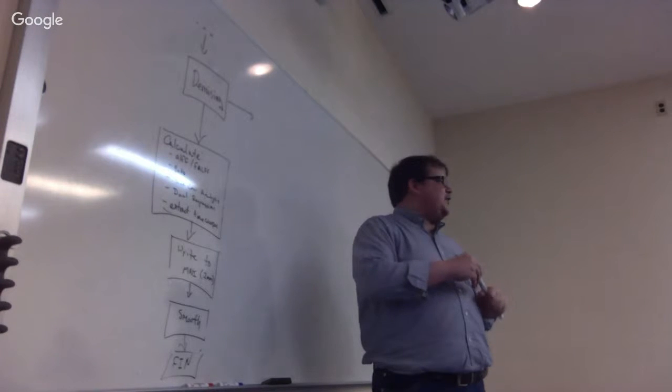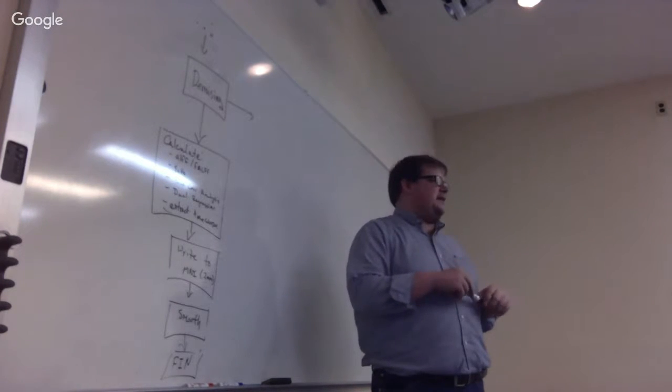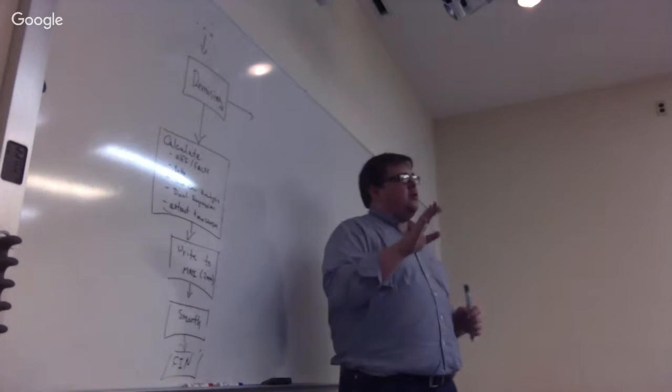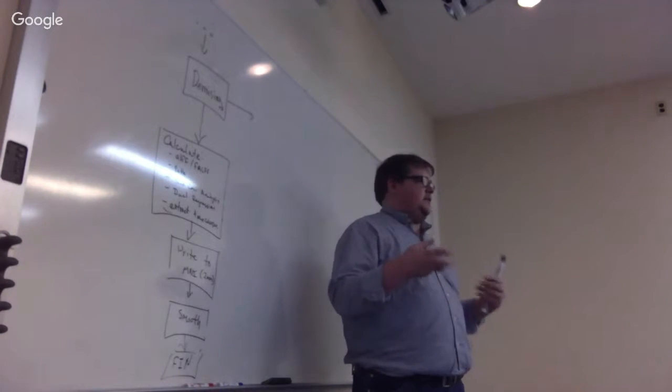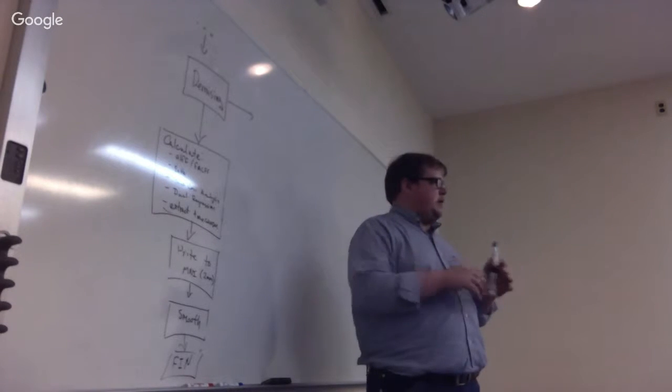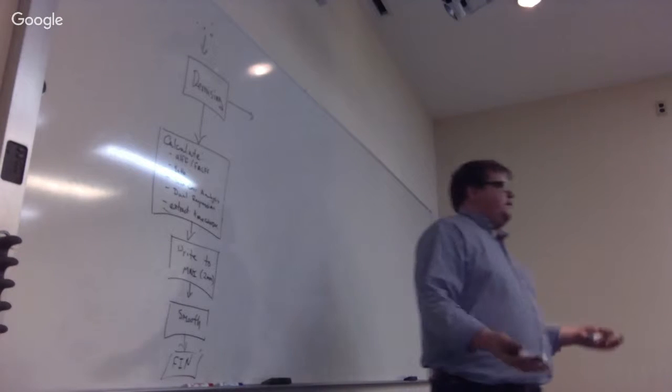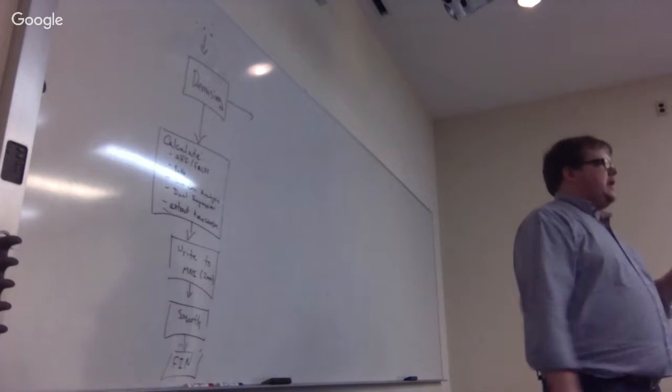And as a consequence, we couldn't log into our server for a month. So even when you do 1 millimeter, it's a lot. So maybe about 2 millimeters you want to specify your seeds, right? You probably don't need the specificity of 0.1 or 1 millimeter. So you should definitely consider that.